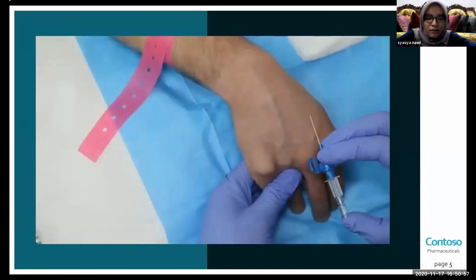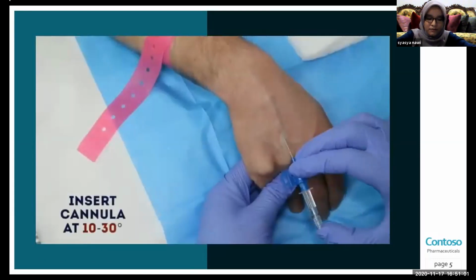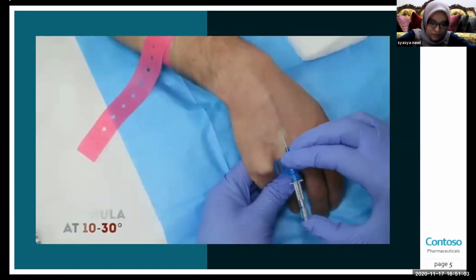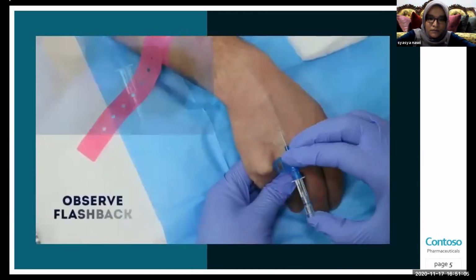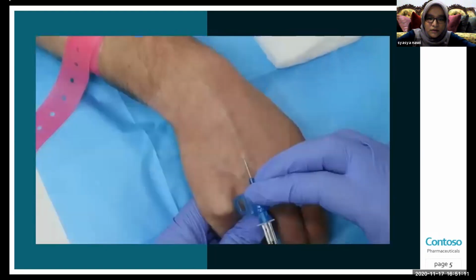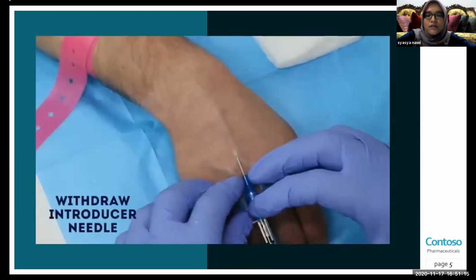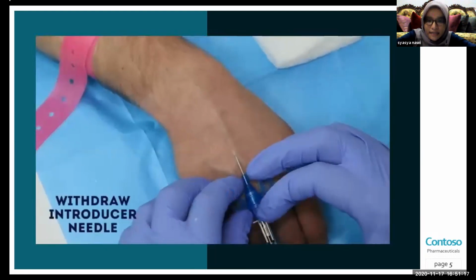Okay, sharp scratch. Okay. Alright. Okay. After that, we withdraw the introducer needle slowly and gently.